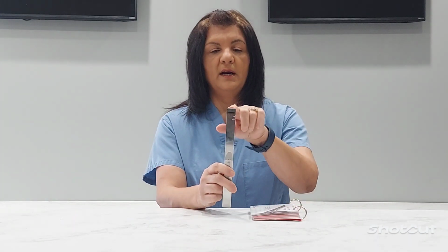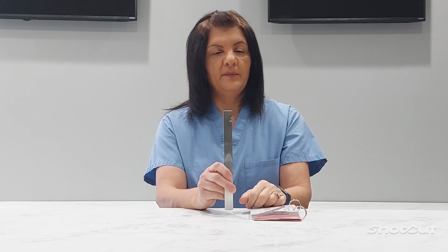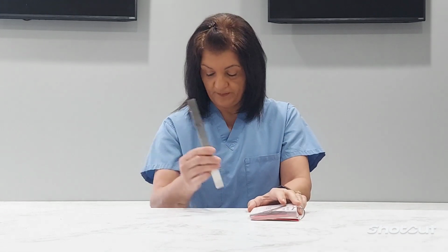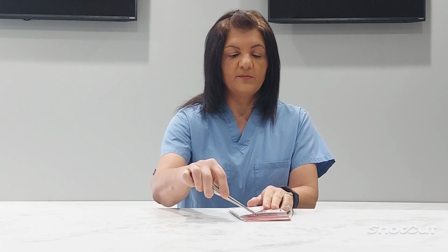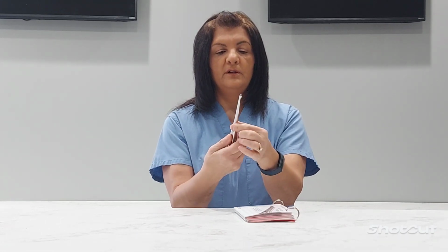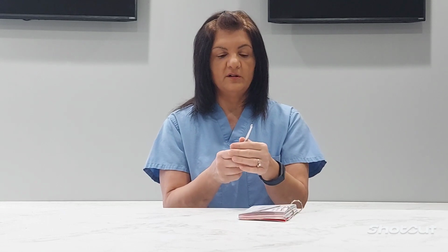This particular osteotome, same kind of thing, could stand for some sharpening at the top, but it has a giant gouge out of the side. So that means that this instrument's been compromised, and there's also a bunch of pits and things on the back of this as well. So that right there tells me that this instrument is not fit for use. You use the same dowel rod to test your curettes. Again, they're supposed to stick into it, and I can tell you that these do not. And also, upon inspection, I can see that this one is cracked all the way around. So that is really not good if they're scooping and this whole thing breaks. The bioburden that's in there and the fact of the harm that would come to the patient from using this instrument is pretty great. So when in doubt, put it in the repair bin.